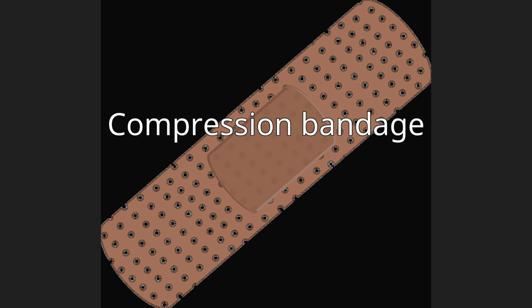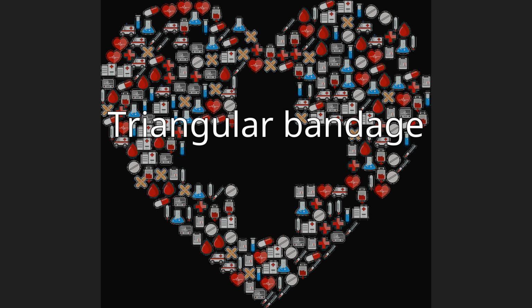Conversely, the stability of the bandage creates a very high resistance to stretch when pressure is applied through internal muscle contraction and joint movement. This force is called working pressure. Long stretch compression bandages have long stretch properties, meaning their high compressive power can be easily adjusted. However, they also have a very high resting pressure and must be removed at night or if the patient is in a resting position.